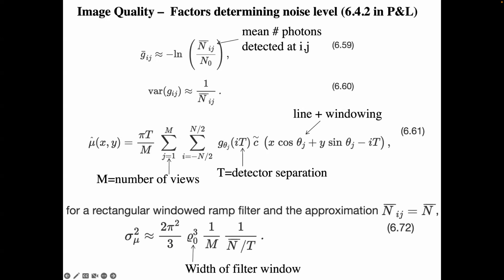So essentially what it means is if I have a signal, we can do it the other way. If I have a signal and I've got 1,000 detectors and my signal to noise, my variance is too high, I can take each pair of detectors and just average them together, and I'll get a lower variance in my scan.